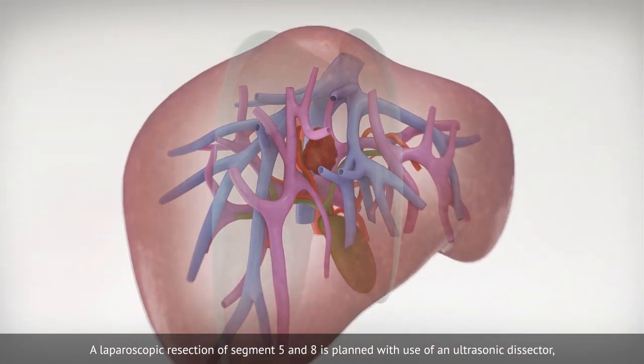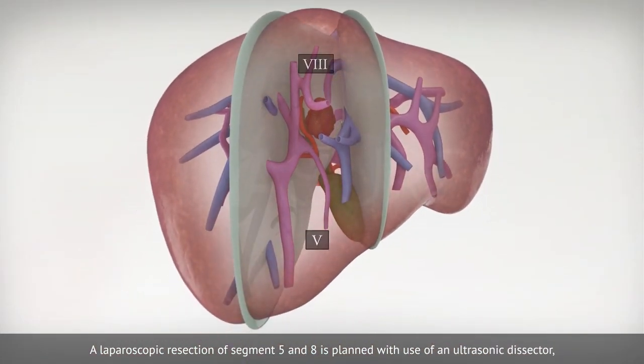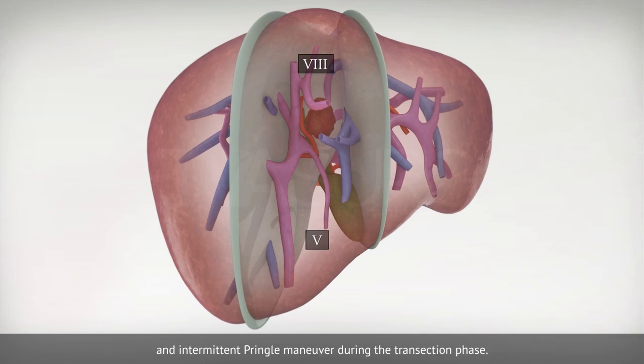A laparoscopic resection of segment 5 and 8 is planned with use of an ultrasonic dissector, and an intermittent Pringle maneuver during the transection phase.